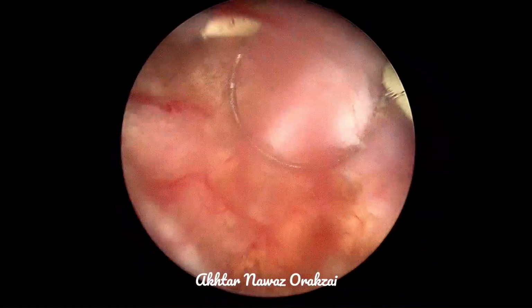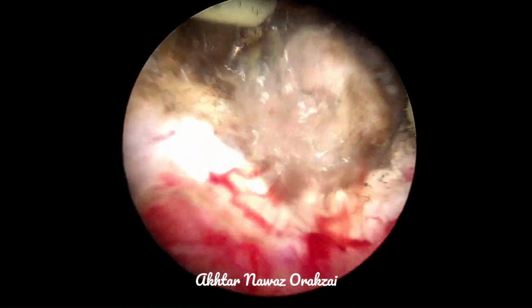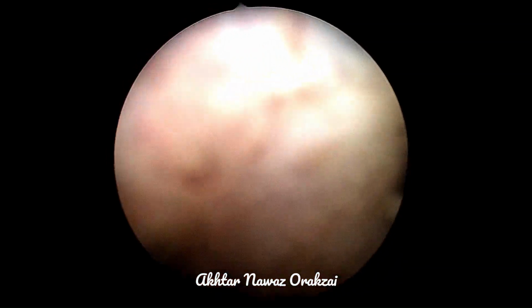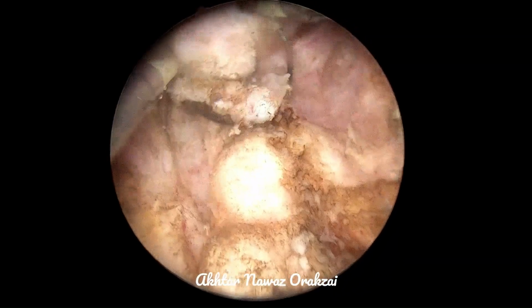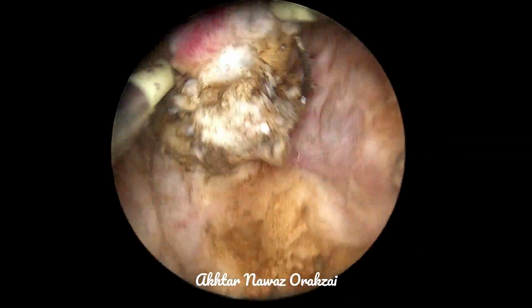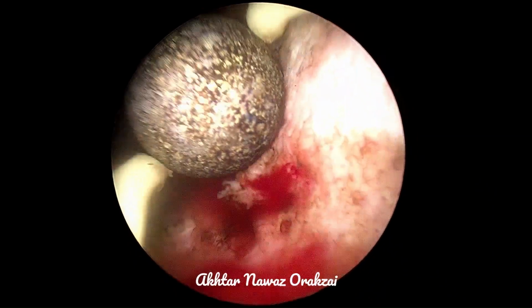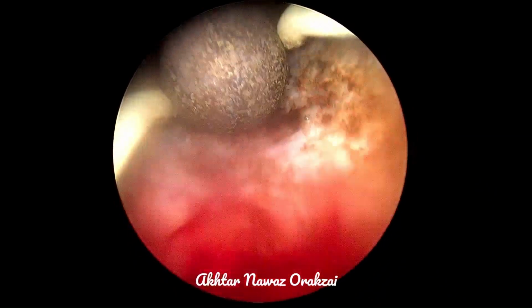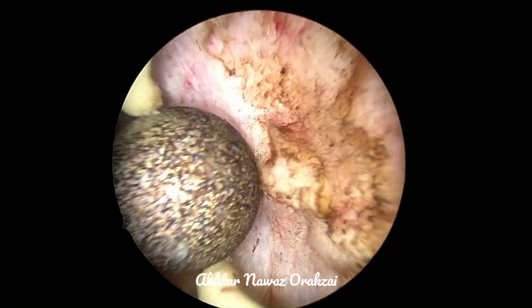So the lesson here for the beginner is that completion can only be decided if the bladder is emptied 2 or 3 times, and that happens automatically when the chips in the bladder are evacuated by the Ellik evacuator. Then you will see that more of the median lobe, more of the lateral lobes have popped up again. So here, a good symptomatically relieving procedure is performed.